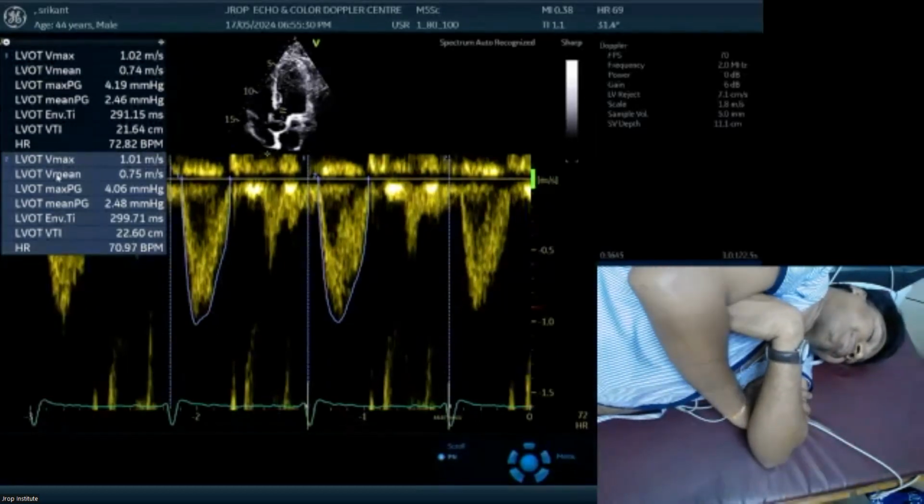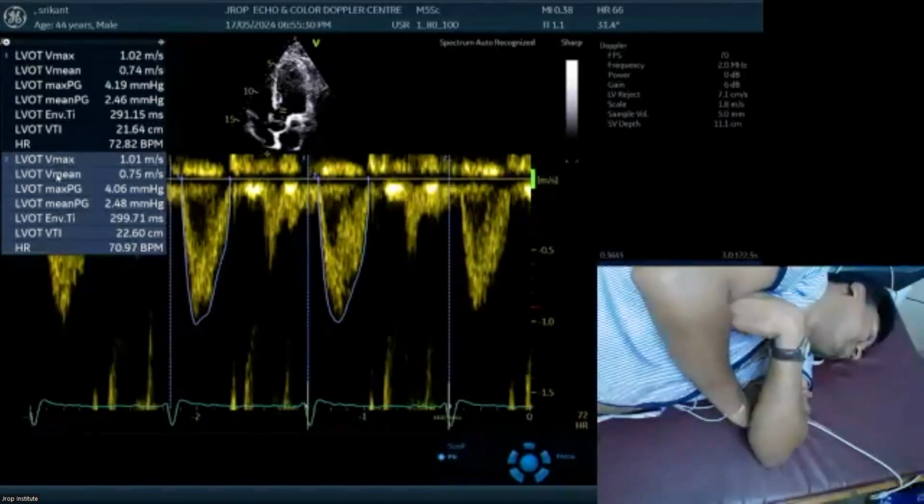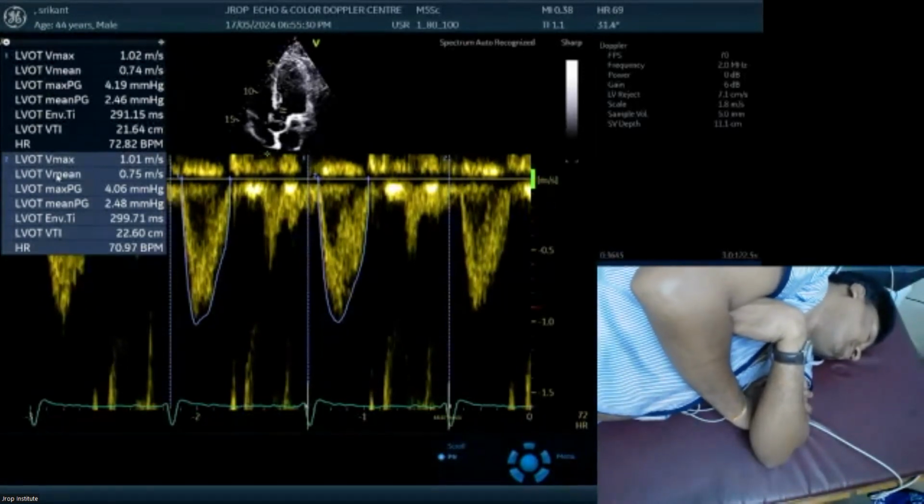Knobology: we will send you a video recording of knobology. See it again and again. The problem with knobology that we have been facing is that everybody has his own machine, and every machine has a different knobology, although the work is the same. Suppose, on the screen I can show you.